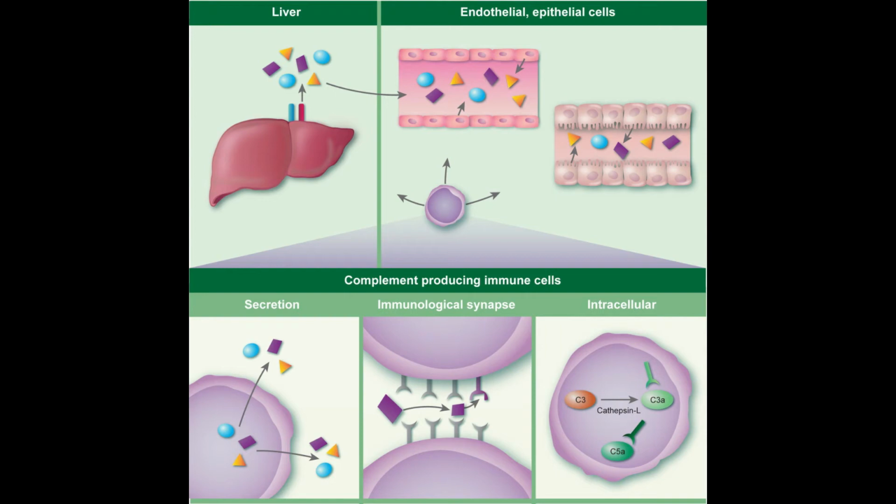Magnesium chloride and ethylene glycol tetraacetic acid are added to the buffer and calcium is left out. This buffer chelates calcium, which blocks classical pathway activation. Rabbit red cells are used as the indicator because this provides an ideal surface for alternative pathway activation.